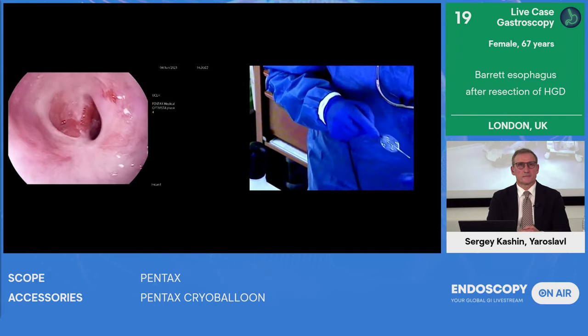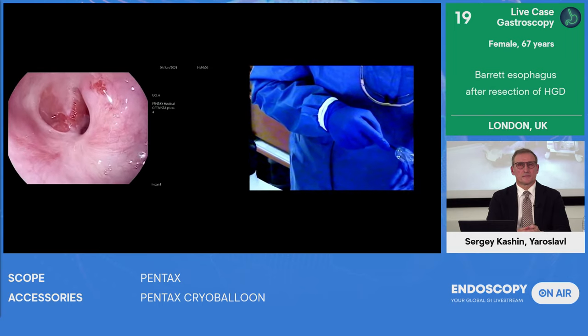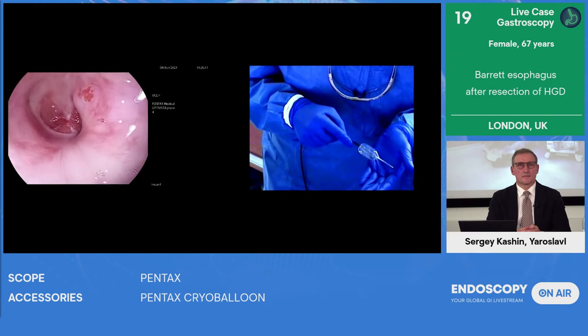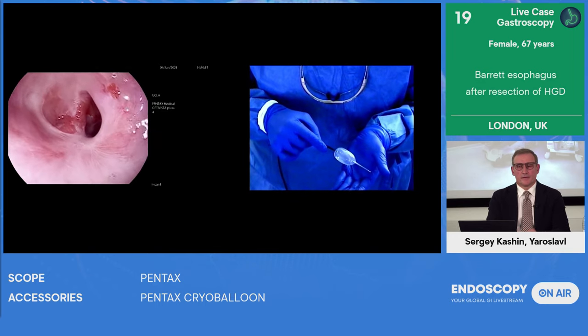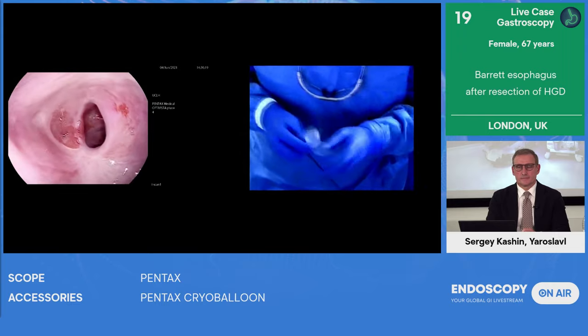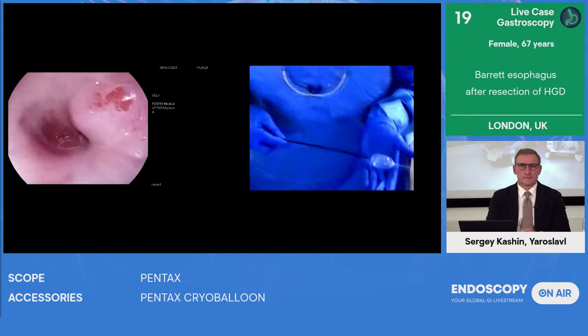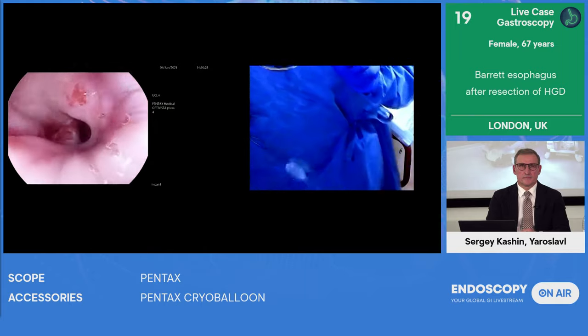I don't know if you can see as you zoom in, there is a little control nozzle in here, which will deliver the cryotherapy. So you can see it just begins to freeze over the catheter. There are two different types of balloon. There's a straight balloon here, which I've just demonstrated to you. And then there's a second type of balloon, which is called the pear-shaped balloon.